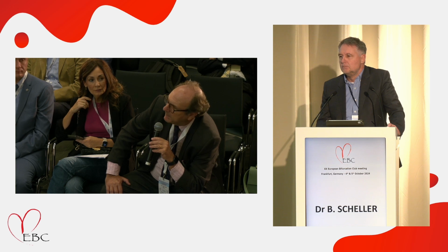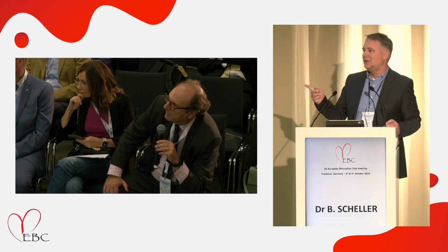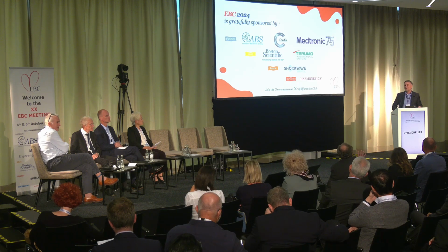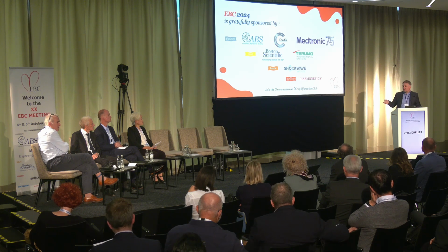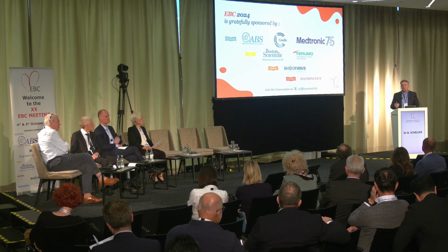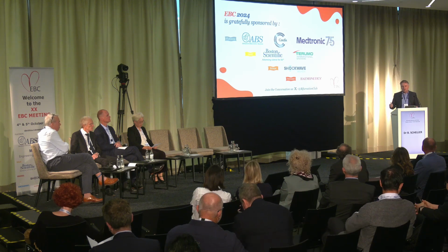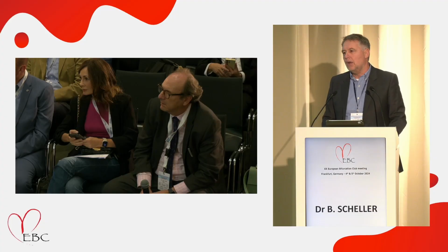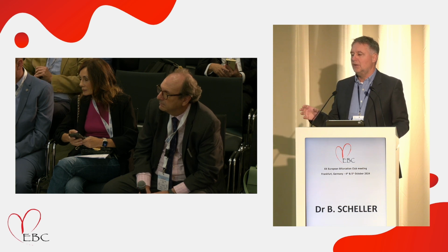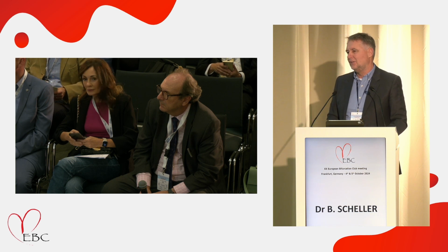Yes. Do you think that these two types of treatment deserve a randomized trial? Yes, I think we will hear about... No, for 001. 001. I mean, we did this PEPCAD-Bif trial, which was a mechanistic trial, and we see that this makes angiographically, against provisional, it's better. I think if you look against drug-eluting stent, there will be no big difference in angiographic outcomes, and it's hard to show a clinical benefit if you treat small side branches. I think that's really difficult to show.